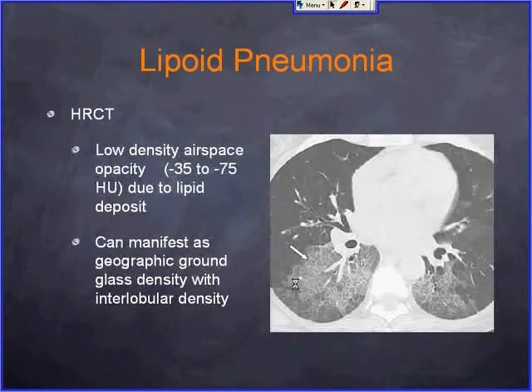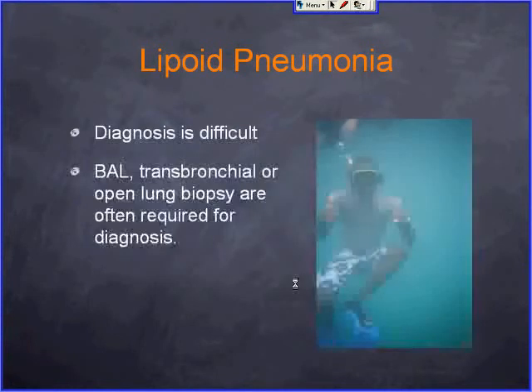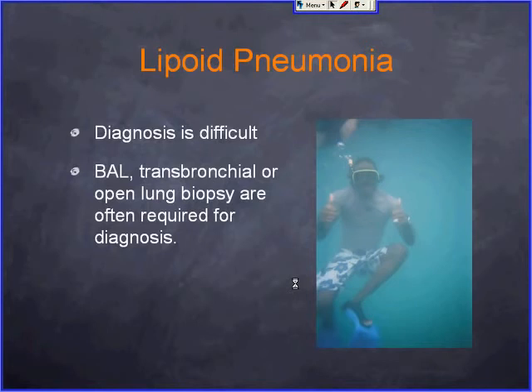On high-resolution CT, the key clue is low-density airspace opacity in the range of minus 35 to minus 75 Hounsfield units due to lipid content. True diagnosis can be difficult and requires a combination of respirology and biopsy pathology.